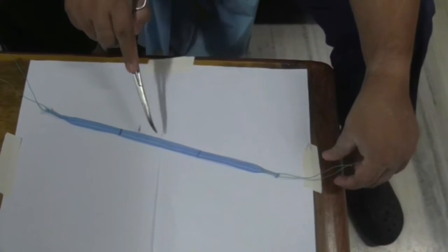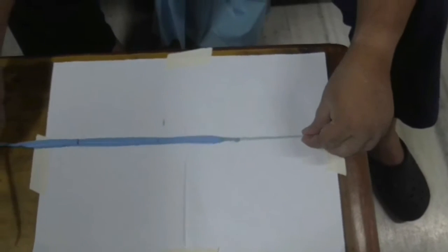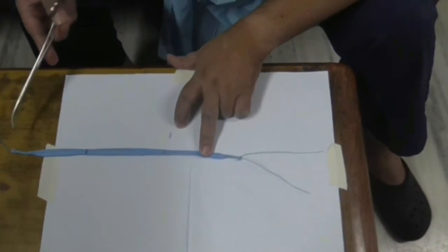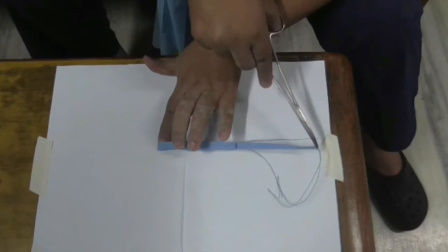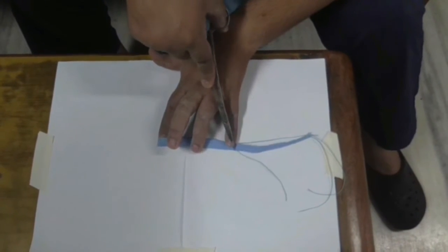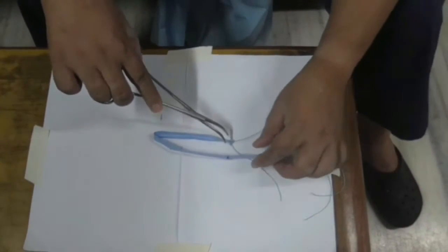Hello everyone. I'm going to demonstrate a simple technique of triplicating a semitendinosus graft. You divide it into three halves, then open your whip stitch from one side, fold it, and get the multiple sutures.